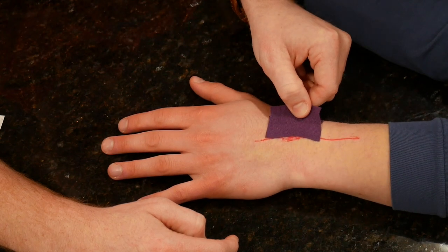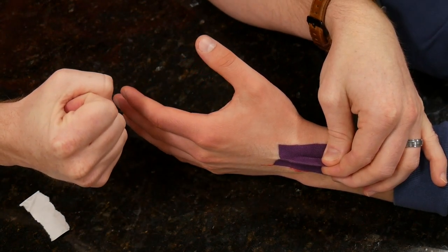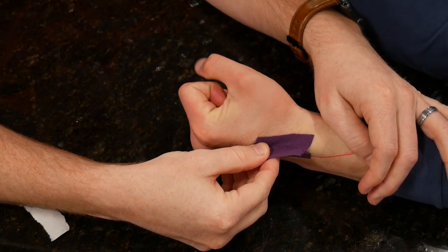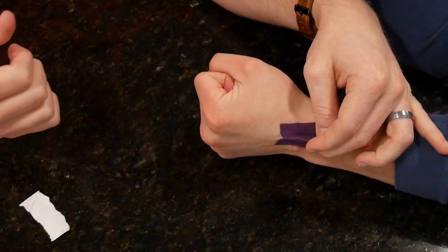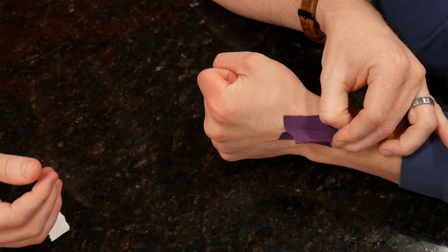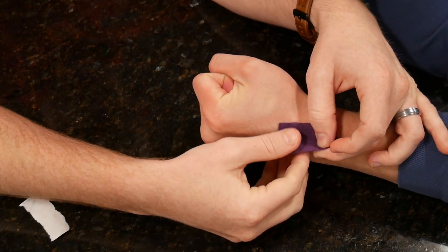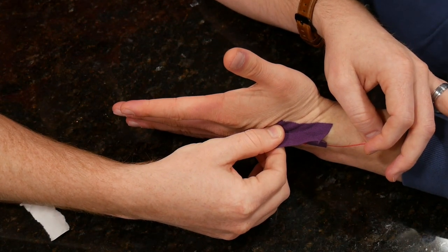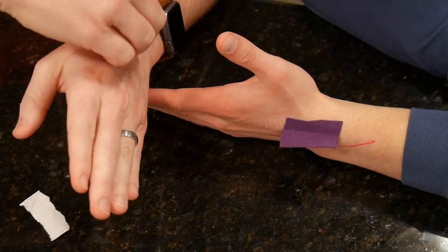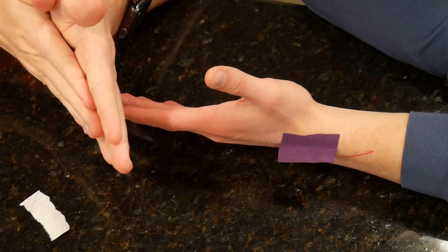Another good thing you can have your patient do is pull and have them bend at the same time. So go ahead and make a fist and then straighten up for me. So you're basically gliding in the opposite direction of whichever way those tendons are going. So I'm pulling it back towards his elbow when he's going into a fist. And then when he's straightening, I'm pulling towards the end of his fingers, so that your scar tissue and the tape that's lifting up on that tissue is going opposite of one another, so we can try to break through those scar adhesions.